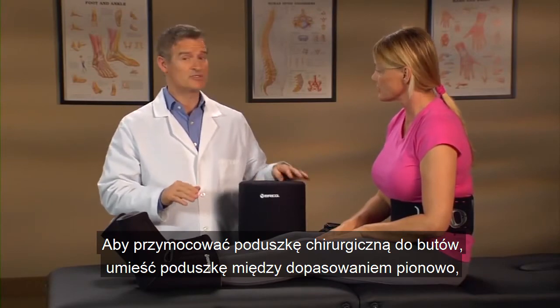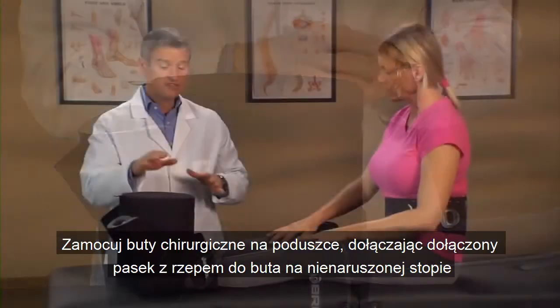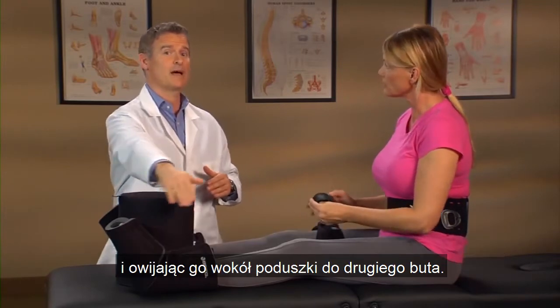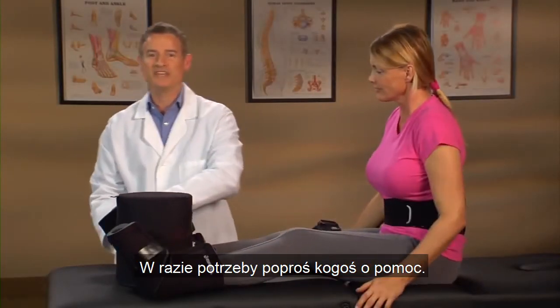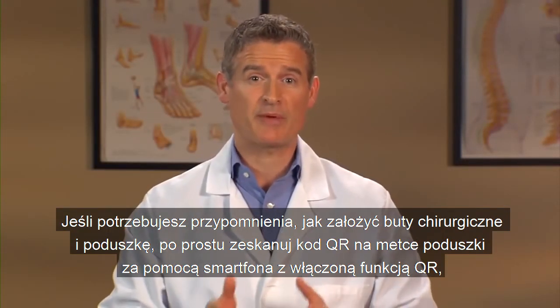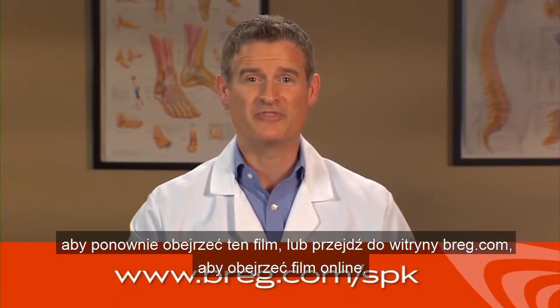To affix the surgical pillow to the boots, place the pillow between the feet vertically so the Breg logo is in the upright position facing you and the tag is away from you. Affix the surgical boots to the pillow by attaching the enclosed hook and loop strap to the boot on the unaffected foot and wrapping it around the pillow to the other boot. Have someone help you if needed. The strap will not attach to itself, so ensure the entire hook and loop strap is attached to the pillow or boots. If you need a reminder of how to put on the surgical boots and pillow, scan the QR code on the label of the pillow with your QR code-enabled smartphone, or go to Breg.com to view the video online.